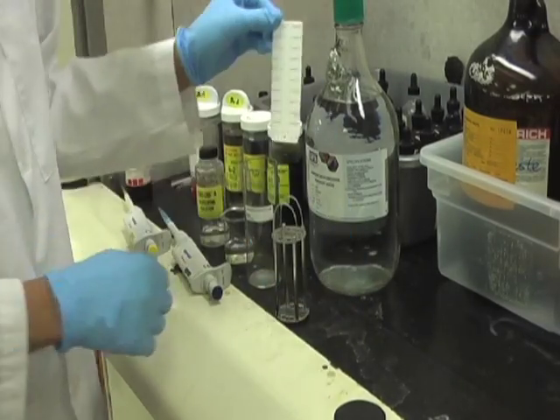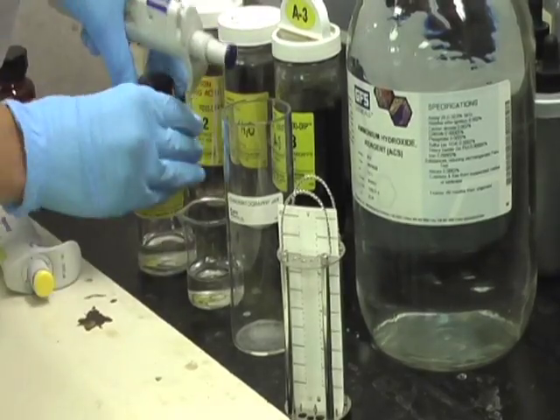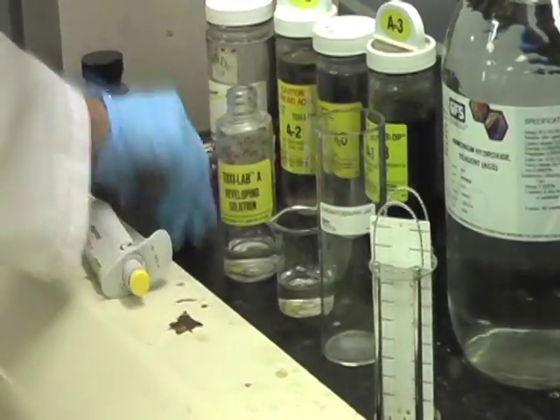Now the Toxigram is placed into its holding container. Add 3 milliliters of the developing solution to the Toxilab jar.